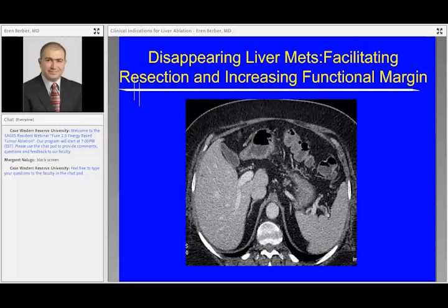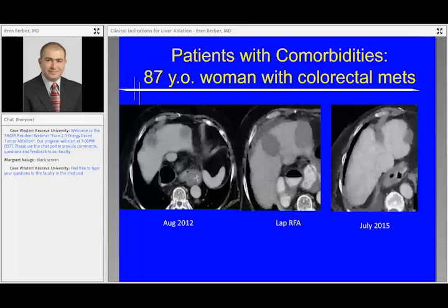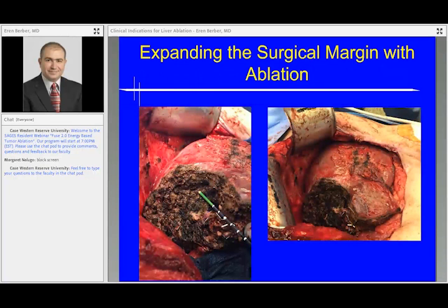Ablation can facilitate the resection and increase the functional margin in these patients. Another group of patients are patients that were too sick to have anything major done. For instance, this 87-year-old lady has two liver lesions from colorectal metastasis. She was brought to the exam room in a wheelchair, and there was no way you could resect these lesions. And this is a patient that I performed ablation on, and 3 years out, there was no recurrence involving these lesions, and actually, interestingly, she didn't have any recurrence elsewhere either.